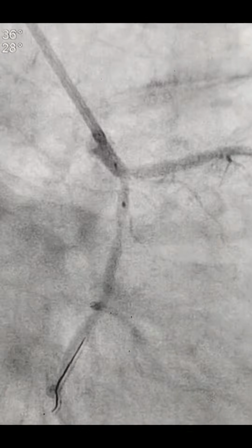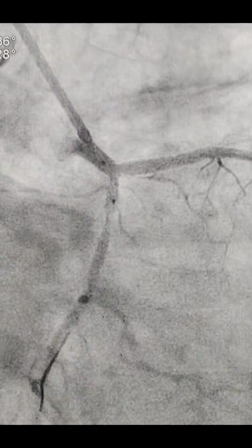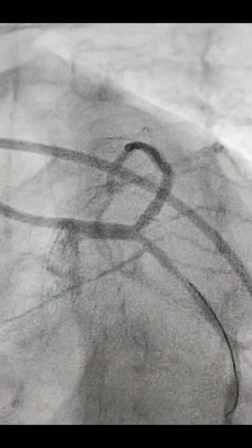And this is the balloon to open the strut into LCX, and then we inflated this balloon. It is a 2.5 balloon. That pinching has improved, so there's no need to put another stent. This was a provisional stenting from LM to LAD for this ostial LAD lesion. So this is the LM to LAD angioplasty, and LCX also got saved.